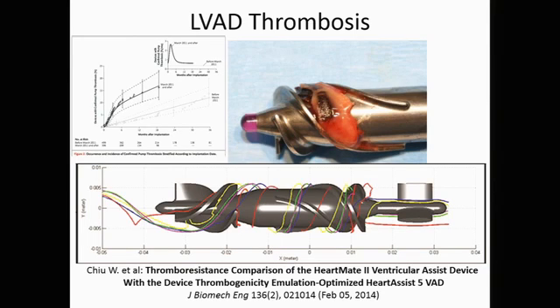So this is a nice figure published in, once again, the peer-reviewed literature. And those clots, they're not quite as big as a match head. A clot that's the size of a grain of rice, a clot that's as thin as a piece of paper adherent to the rotor of these devices is sufficient to produce turbulent flow and device failure. So when people say, oh, this device is thrombosed, don't think of this person as having a tip-of-your-pinky-sized clot anywhere in this device. We're talking about something the size of a grain of rice, a match head, something that's thin and extensive, like a piece of paper covering some portion of the rotor.